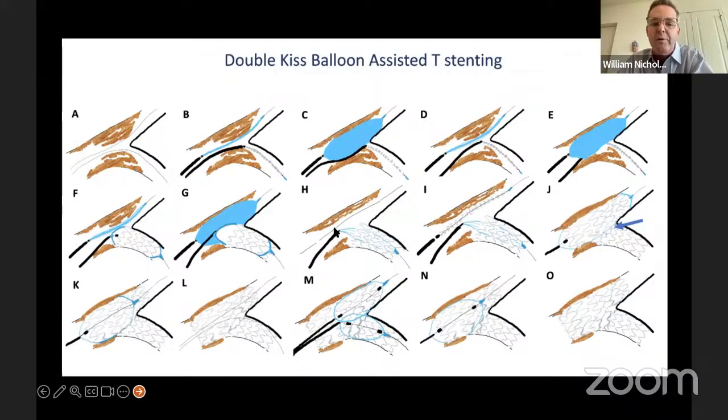And so with the balloon in place like this, it acts as a bumper balloon. So when your new stents pass through in panel I, it doesn't catch on the edge. And so you can get it into position where now when we inflate it, you'll be able to push it up, and it does fold this last strut up into the carina. And you're left with the gap at the other side that everybody worries about.